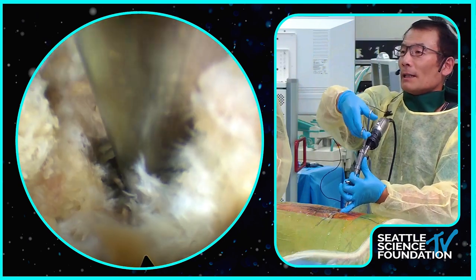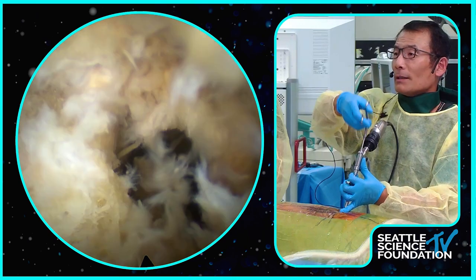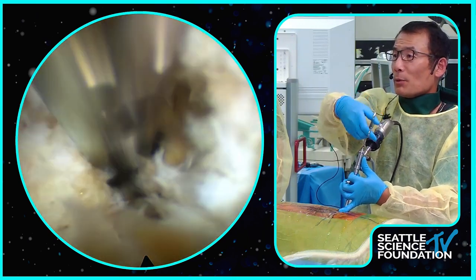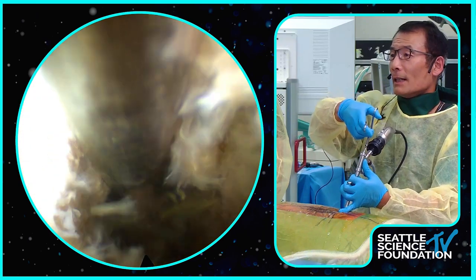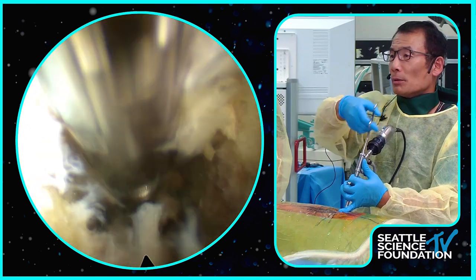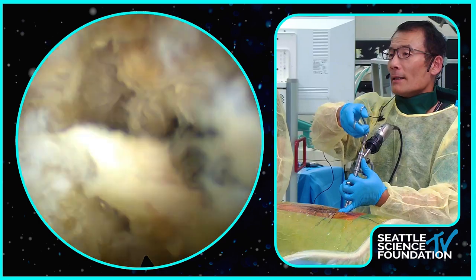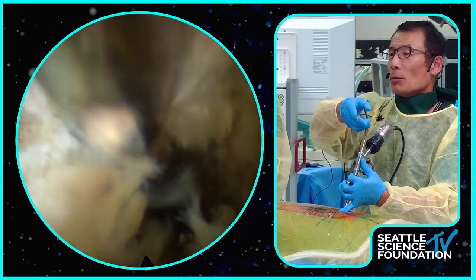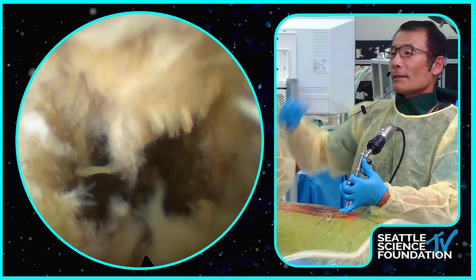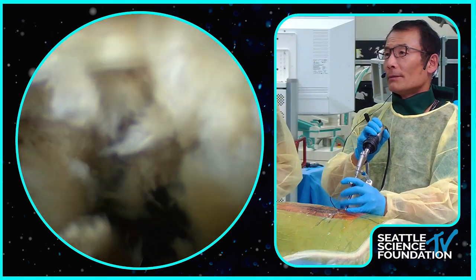After I do the discectomy decompression, before I put the trial or the cage, I switch to a matrix tube, like a 14 millimeter matrix tube. Then I place my scope through that tube and make sure the nerve root is not in the way to place the trial or the cage.